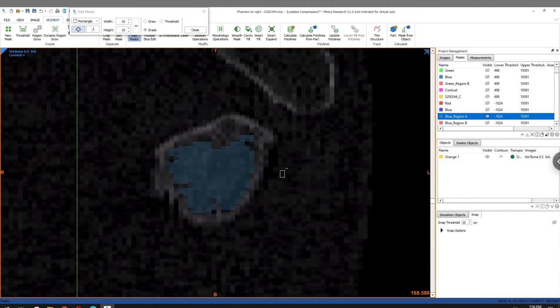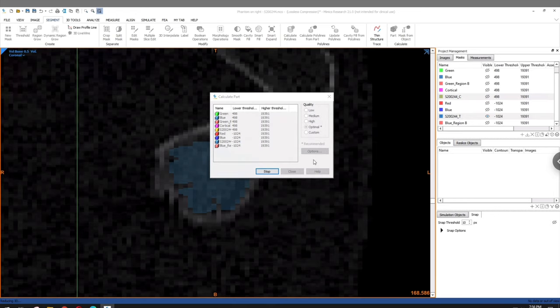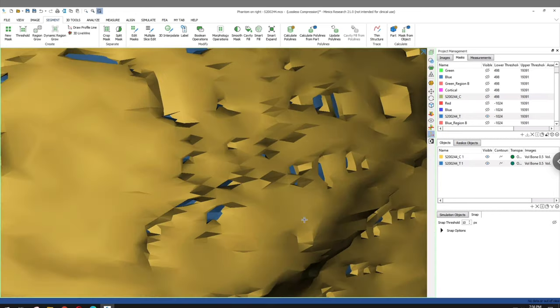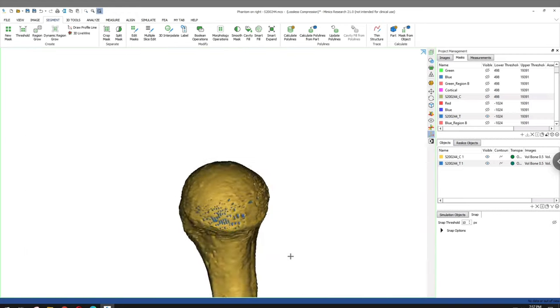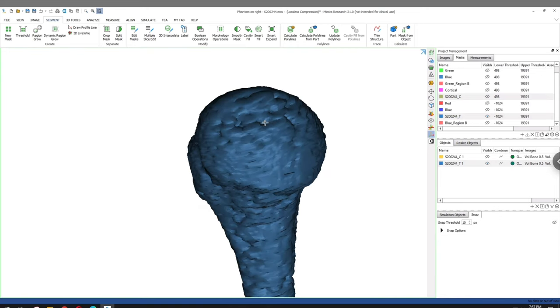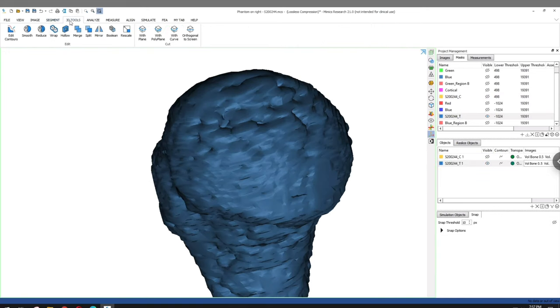There is a way to get rid of those within the 3D models, but I find that sometimes using the automatic functions of Mimics can be a bit finicky, so my suggestion is just to do everything manually in this context of really trying to differentiate between cortical and trabecular bone. Now, as we get into performing operations on our 3D model here, I would very much suggest that you perform any operations on the trabecular interior first.